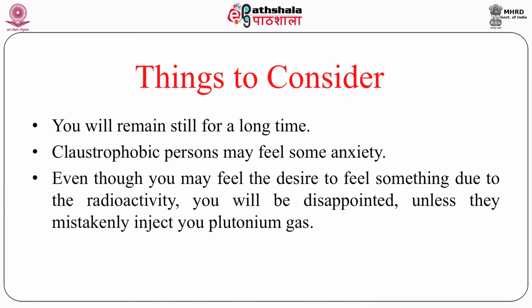Now, what are the things to be considered? You will remain still for a long time; definitely you have to wait for 45 minutes before the scan is carried out. A claustrophobic person may feel some anxiety because you have to be in the PET scan for a long time, for 25 or 30 minutes, and you have to be placed. They may feel some discomfort.